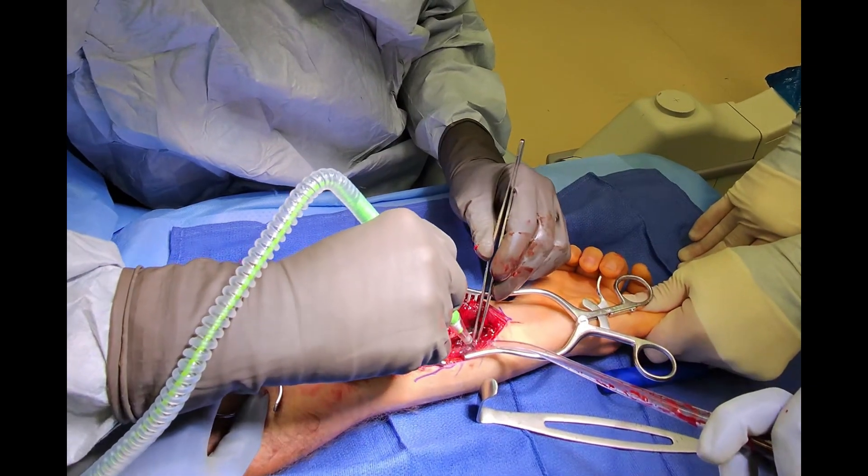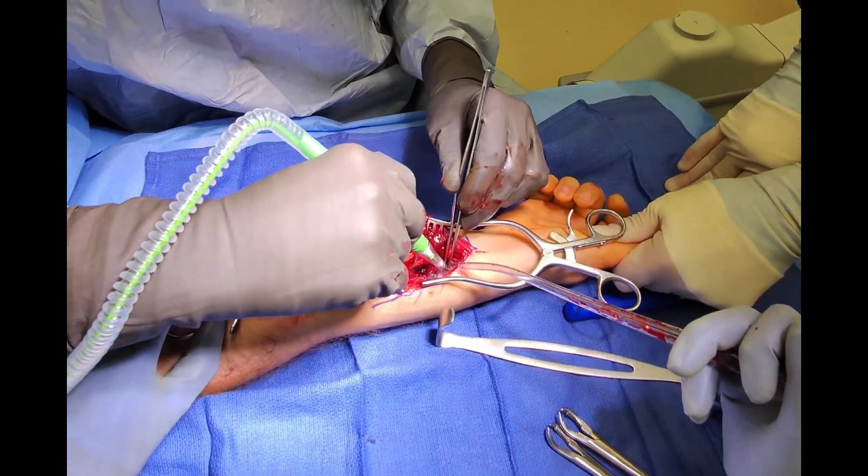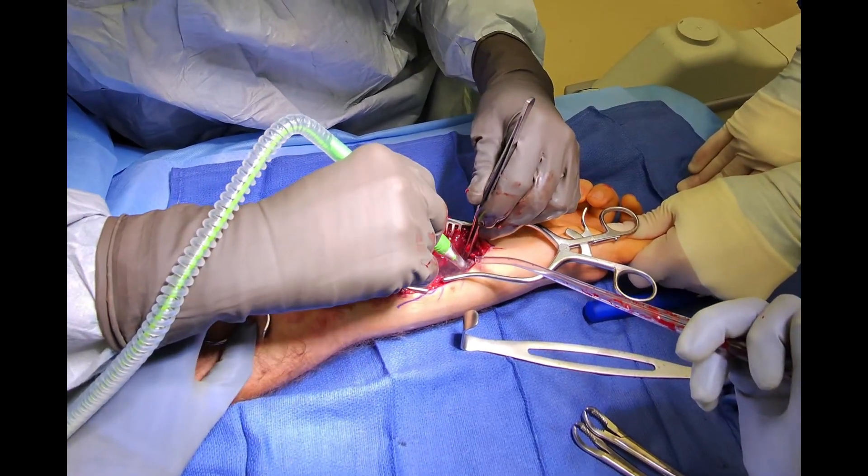We use the electrocautery knife and elevator tool to clear away debris and free up tissue around the fractured ends of the bone, to allow us to mobilize the bone and reduce it to its anatomic position.